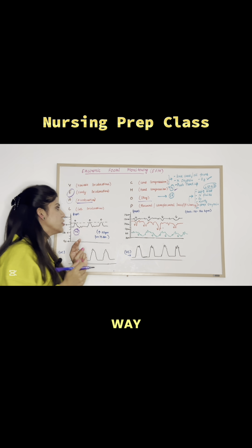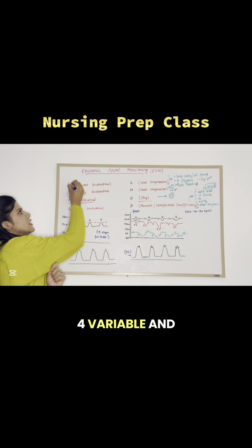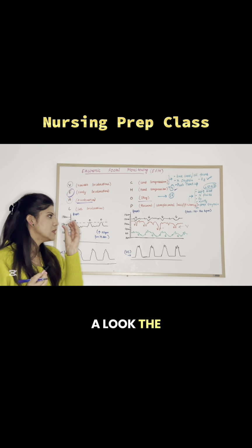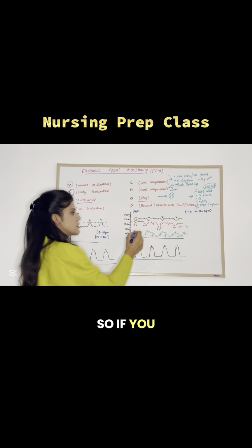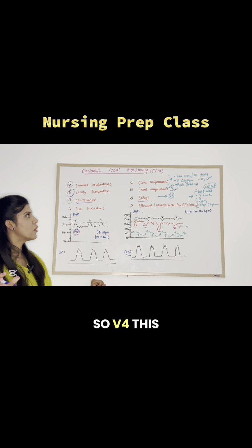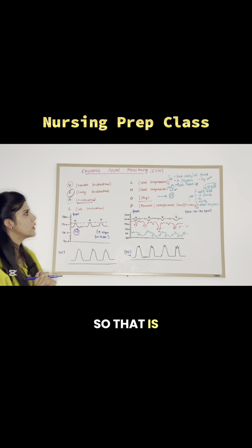Also, there's another way you can find out in the graph that it is of variable deceleration. That is V for variable. And right here, if you take a look, the dipping that you can see on the graph is also forming a V pattern. So if you take a look carefully, they're all forming a V-shaped pattern. So V for this graph, which is forming a dip on it. So that is variable deceleration.